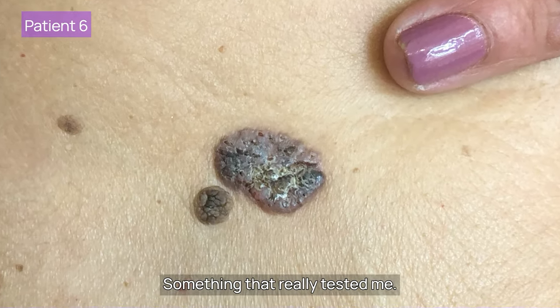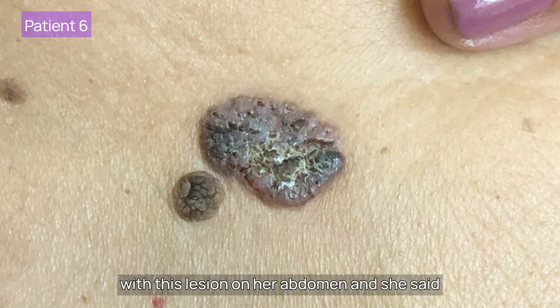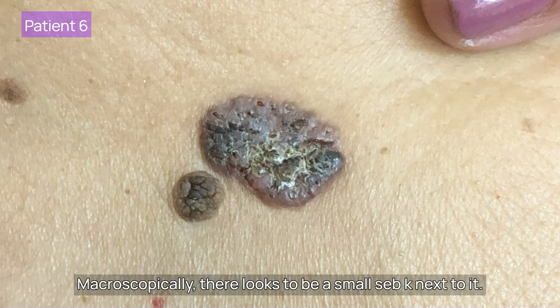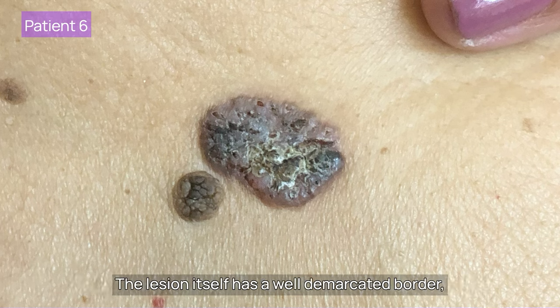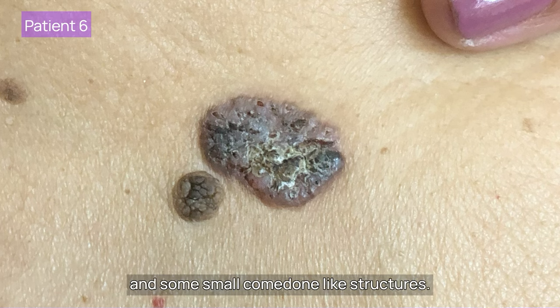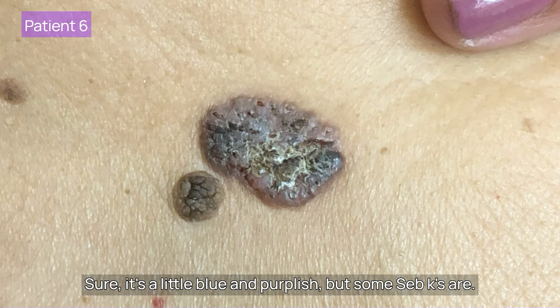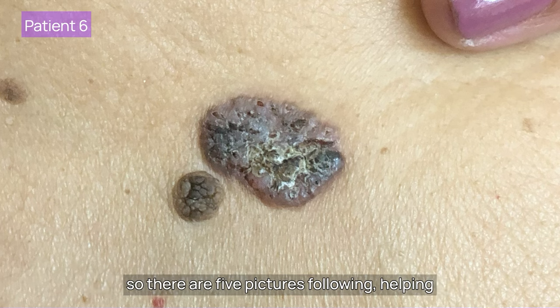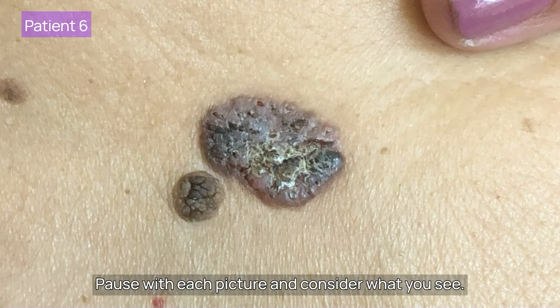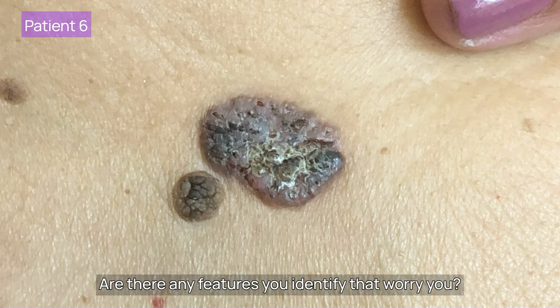And finally, patient six — something that really tested me. This 45 year old lady came to a colleague with a lesion on her abdomen that had been growing for perhaps six months, with no other symptoms. Macroscopically there looks to be a small Seb K next to it. The lesion itself has a well-demarcated border, stuck-on appearance, some keratin on top and some small comedone-like structures. Sure, it's a little blue and purplish, but some Seb Ks are. I couldn't fit all the lesion on one view, so there are five pictures following to help you work around the edge of the lesion. Pause with each picture and consider: is this a Seb K, and are there any features that worry you?